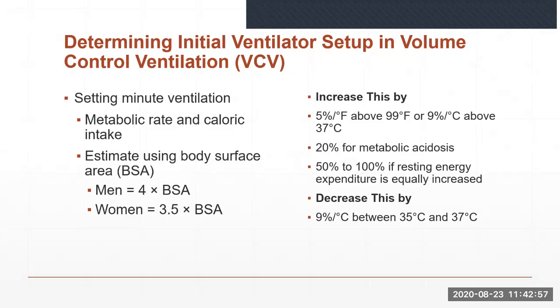Indirect calorimetry, which uses measurements of inspired and expired oxygen and carbon dioxide to estimate energy expenditure, can be accomplished with significantly less time and effort. Advances in computer technology have made it relatively easy to perform indirect calorimetry in the clinical setting.